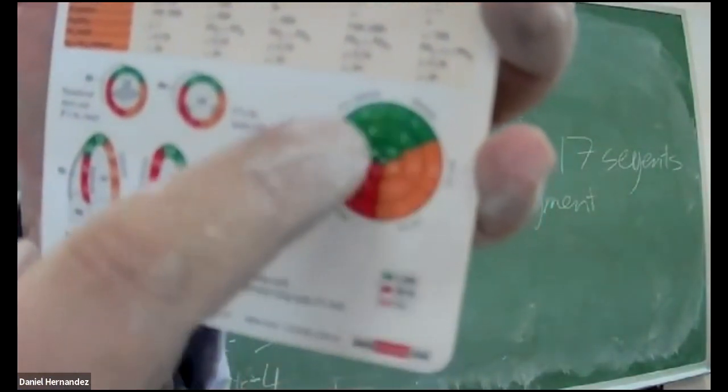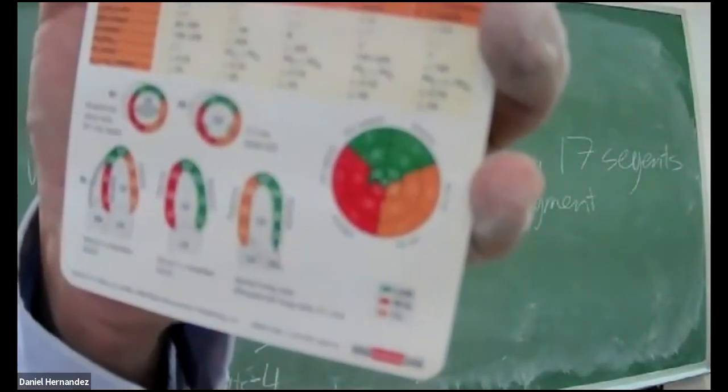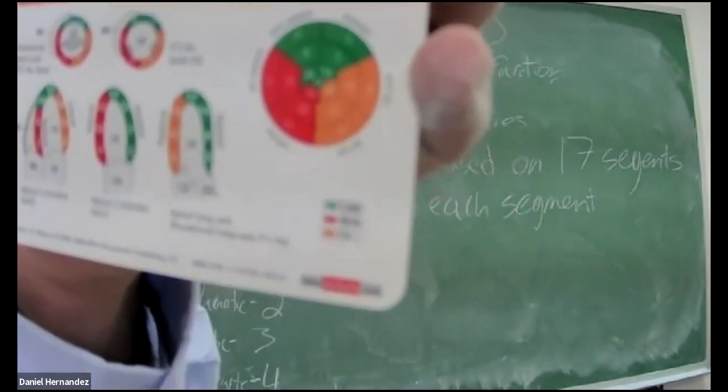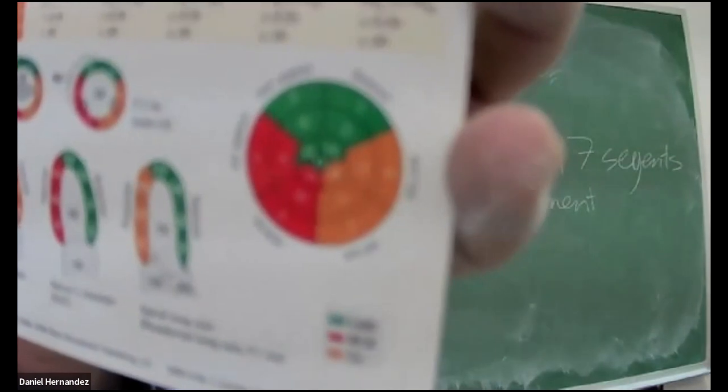So in this little chart here, I'm going to zoom it in. You can see this is almost like a parasternal short axis view of your ventricle, kind of 3-dimensional. Each segment has a little number associated, 17 being the tip of the apex. So you can imagine how difficult it is to add up a score and give a score for each segment to create a wall motion score.